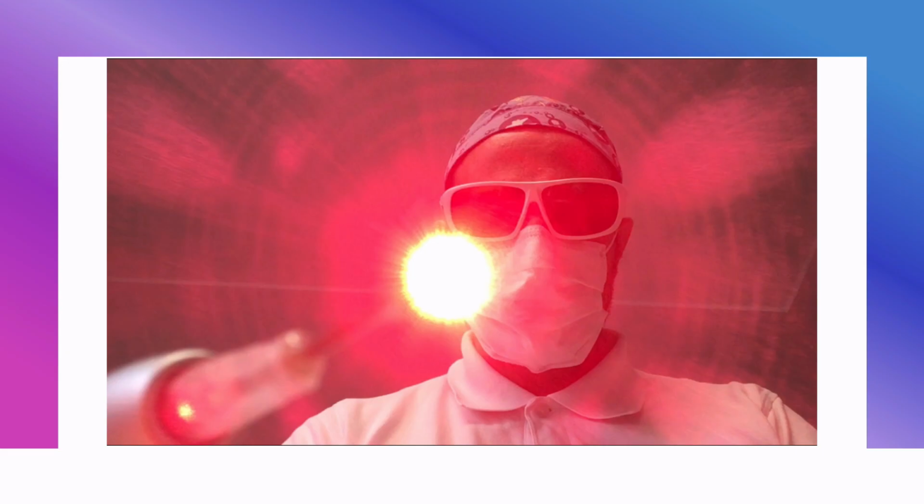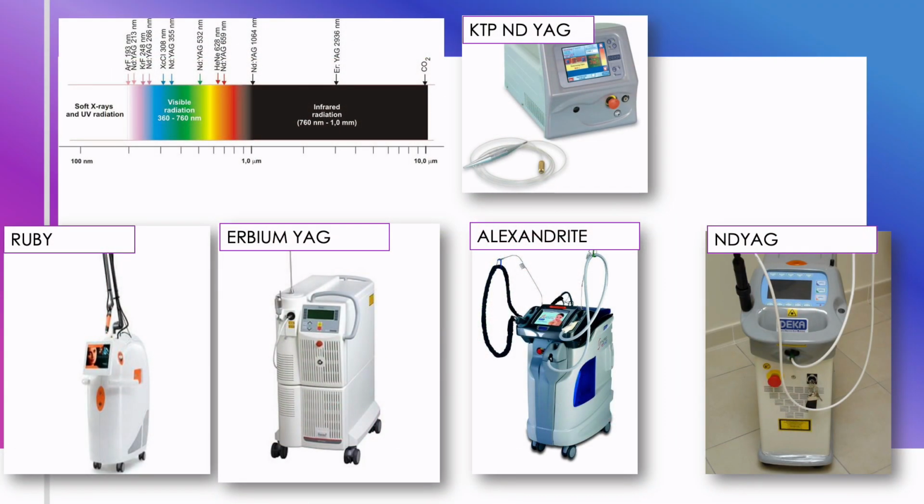As introduced, different modern technologies and techniques show promising application and mutual interactions. Among these, the laser is certainly an instrument of great interest due to its well-known biostimulation effect, antiseptic properties, hemostatic and minimally invasive abilities. Different types of laser with specific wavelengths have been used in the past years in medicine. Among these we can list KTP and Nd:YAG, erbium YAG, CO2, alexandrite and ruby laser.